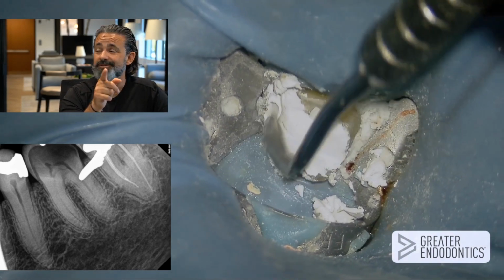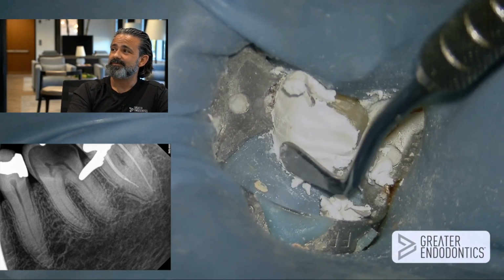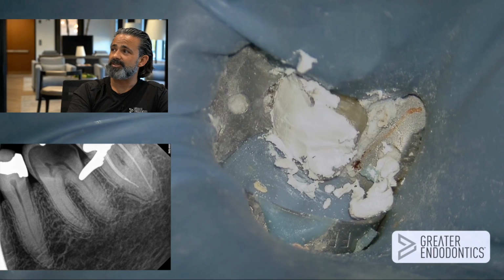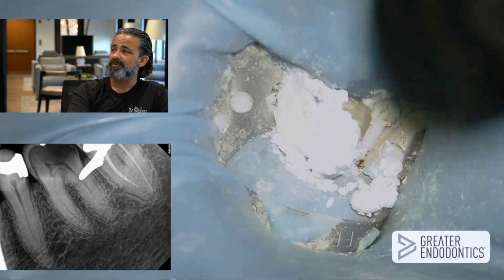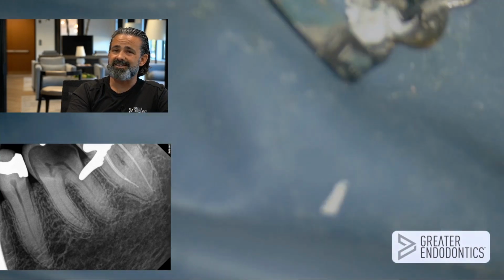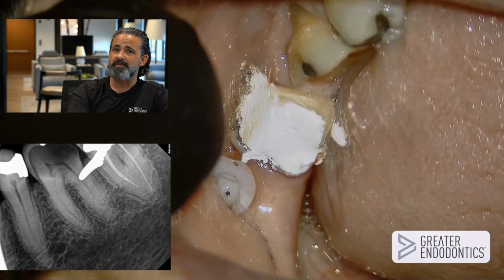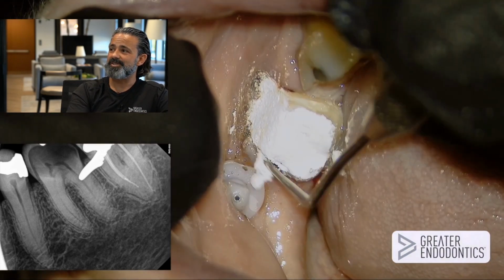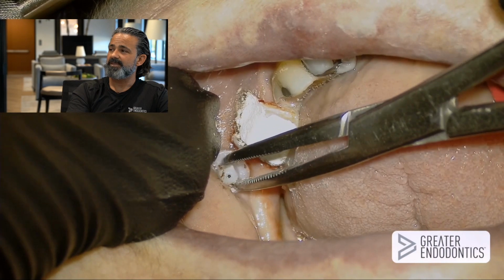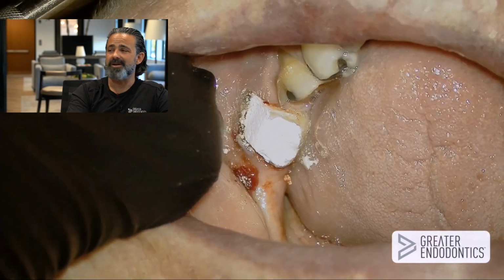Now the question is, what would you guys do? Would you put a post in there or not? Comment and tell me what you'd do. There's a million and one ways to build this tooth back to function. And I'm just going to smooth it down and take this off, and let's get this cleaned up. Trying not to dislodge the temporary material. Sometimes the best tool is your finger to smash it in. Just going to define the outline form of the tooth. Let's take this little X-tip out. And there's my compromised tooth without compromising care.